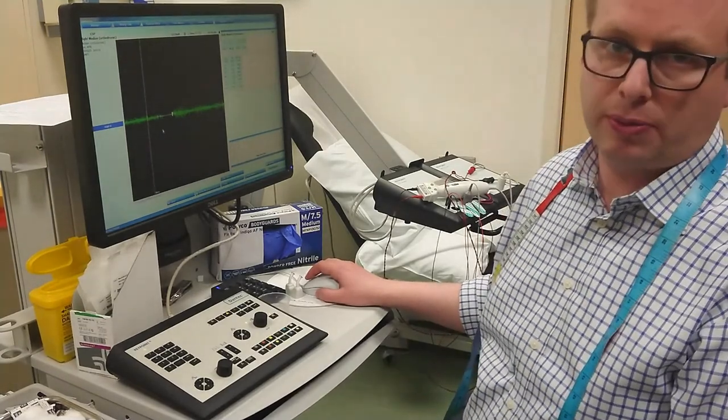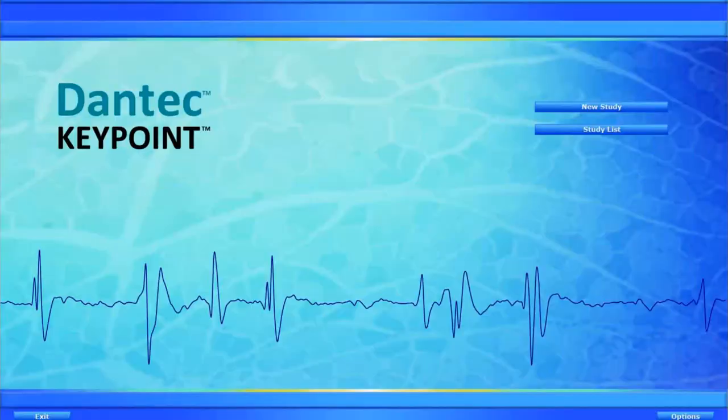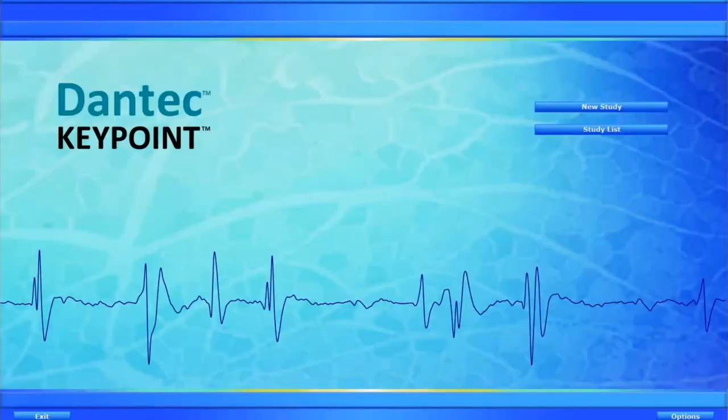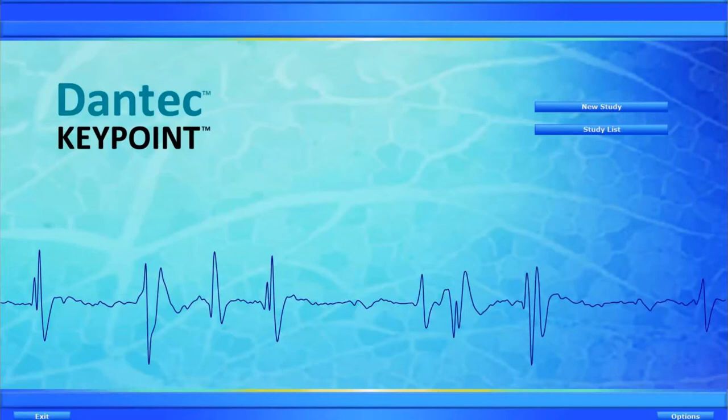Now let me show you how you program it in. What we're trying to achieve here is to be able to record surface EMG whilst also providing an electrical stimulus and to be able to record the latencies of the cutaneous silent period. Now, there isn't a native option of measuring this in the Keypoint.net program.